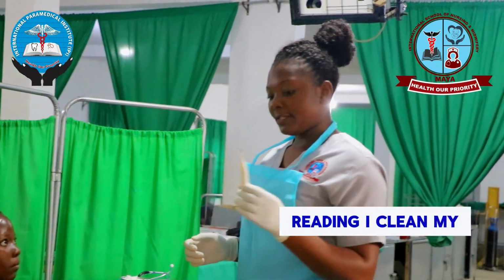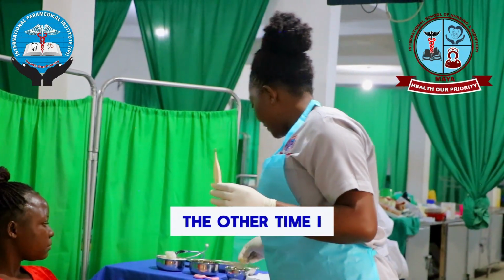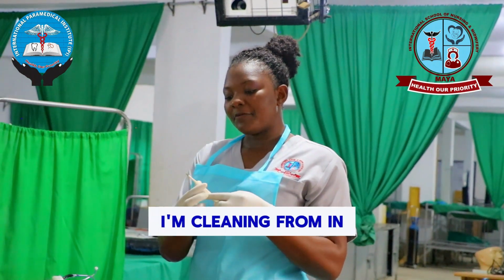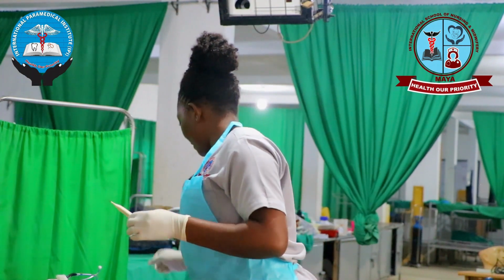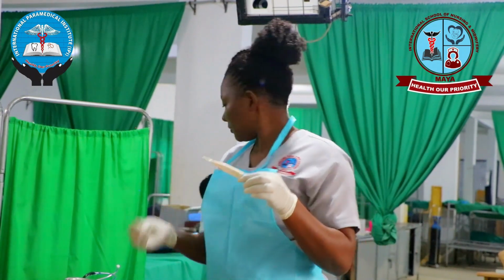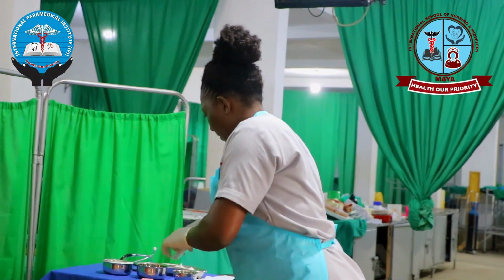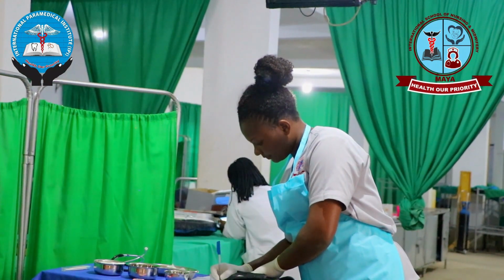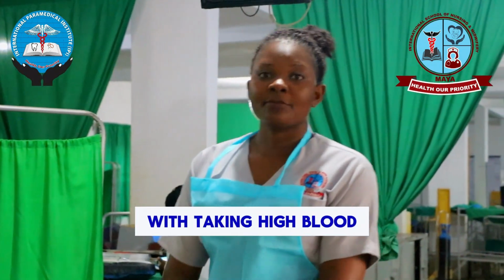Then, after obtaining the reading, I clean my thermometer. The other time, I cleaned inside out, outside inwards. Now, after removing this thermometer, I'm cleaning from in out, like that. And then I dry, still from in out. After drying, I'm putting back my thermometer. Then I record her temperature. So from there, I'm going to proceed with taking her blood pressure.